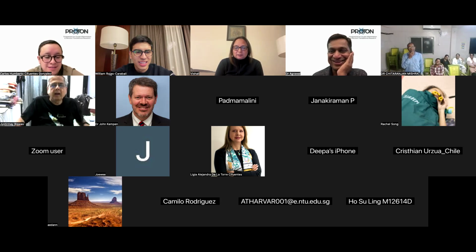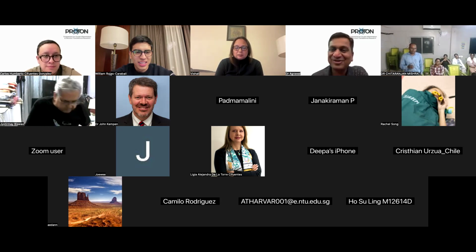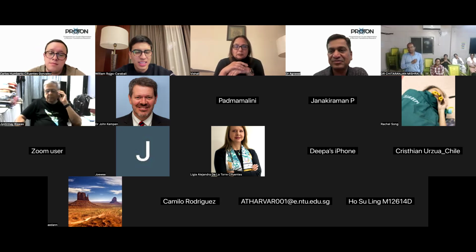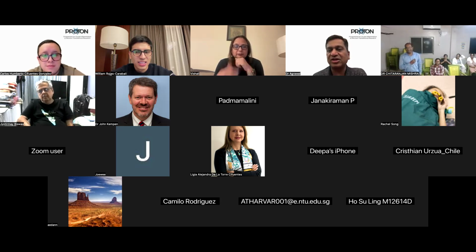Most of the images are from Claros actually. Both Claros and Optos qualify for ultrawide field, so it is Optos less often and Claros most often. Fantastic. And Montas, like I said, one Montas with you, because currently where I'm working, we don't have ultra wide field over here in Sambalpur. But during my Arvind tenure, we had access to Optos and Claros, so there we were doing these things. Keep up that good work, and you can contribute to Dr. Vishali's class on imaging in uveitis probably.